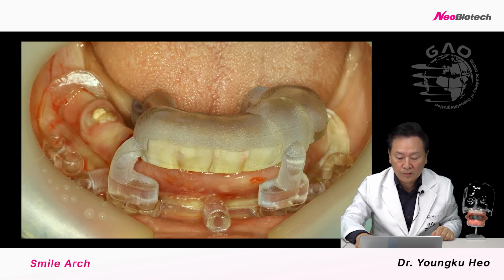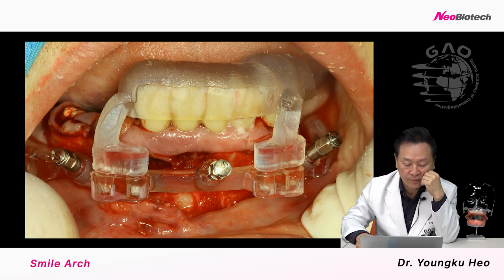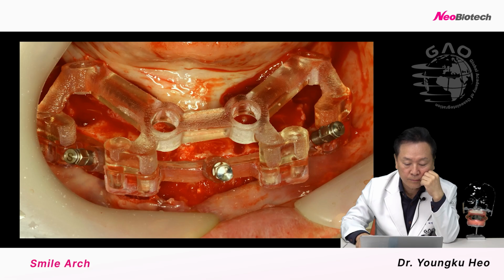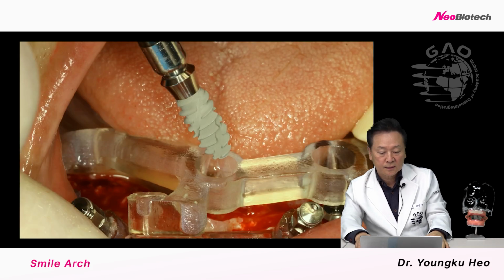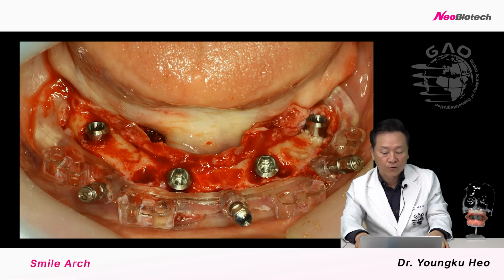This is before extraction. We connect the base bone reduction guide framework first, and reduce the bone, and place this stackable surgical guide, and place the 4 ALX implants.